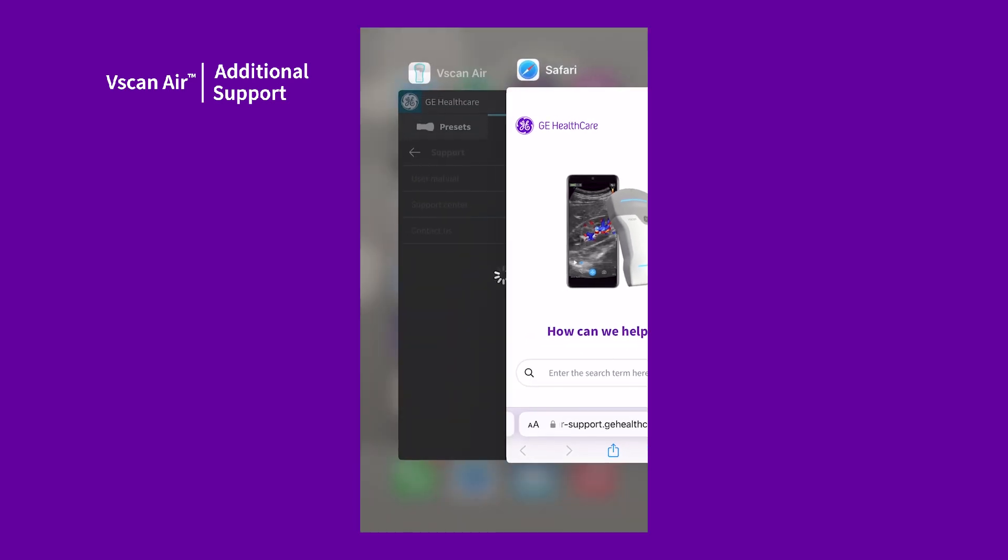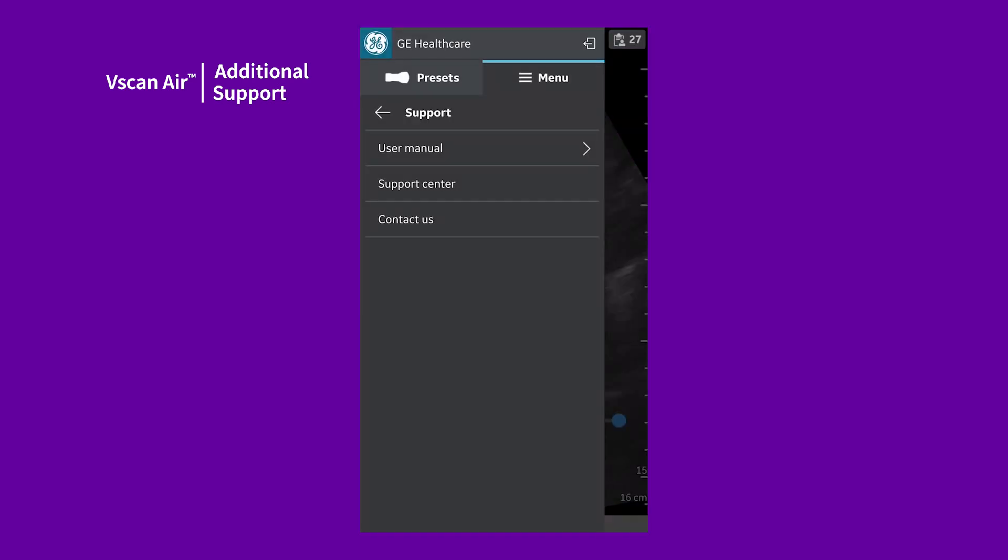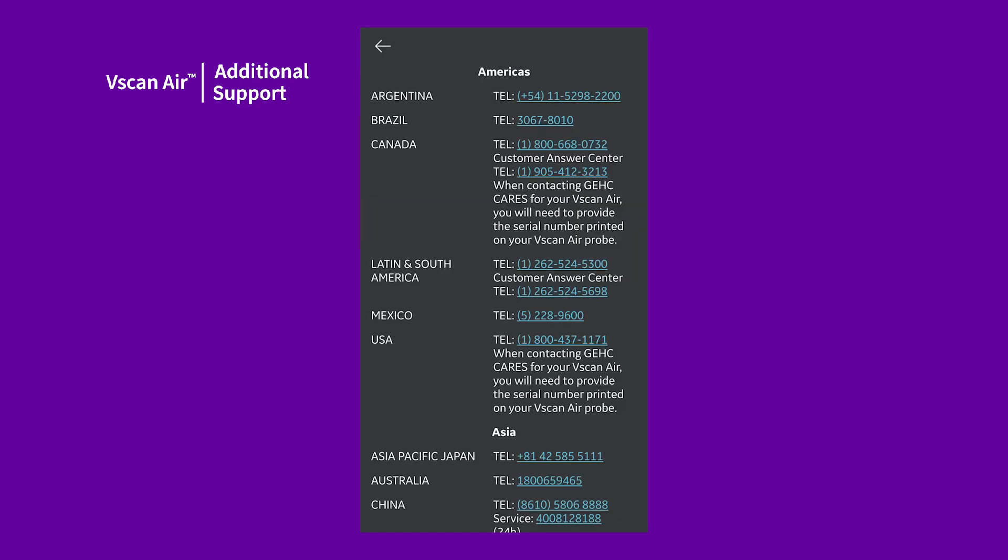Close your browser and return to the app. Tap Contact Us to access a list of GE Healthcare Service contact numbers for different countries.